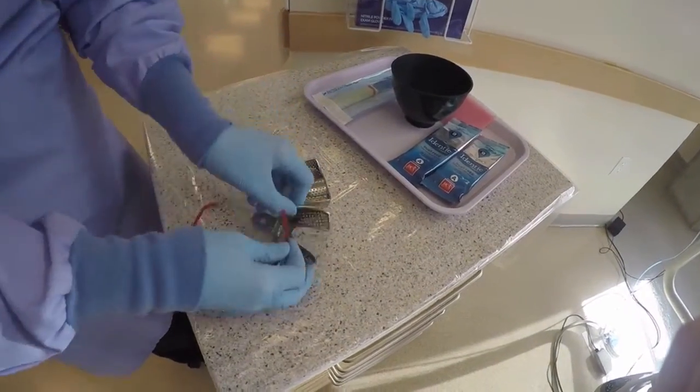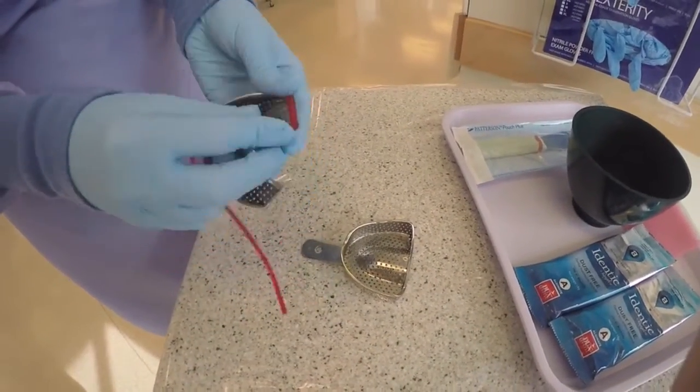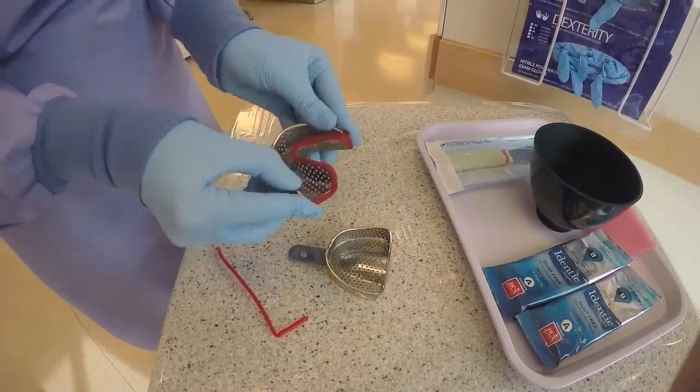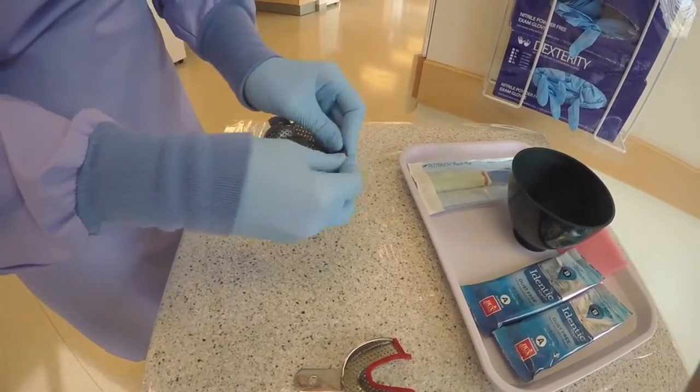Once you have found the appropriate trays, you will add the wax strip to the posterior portion of the tray for patient comfort, as well as adding space to the tray to capture a patient's third molars.